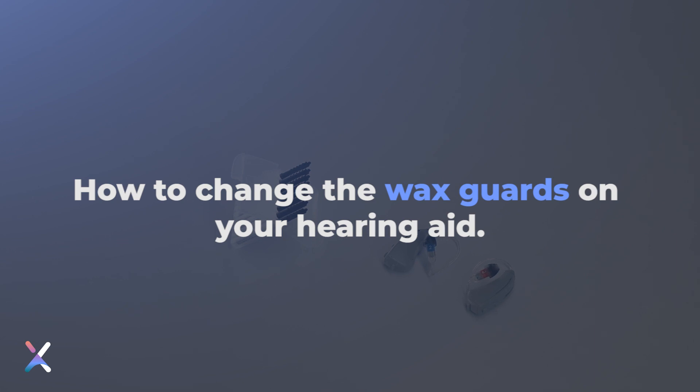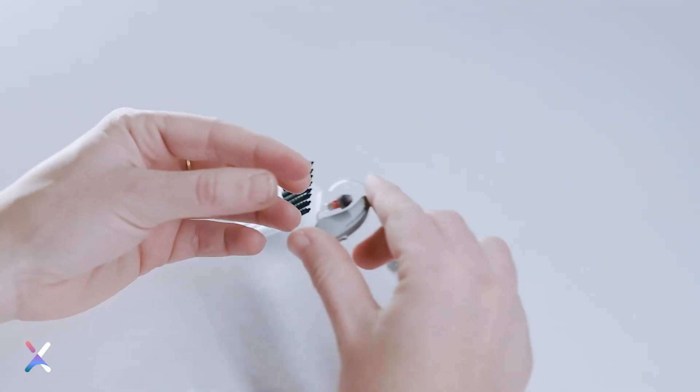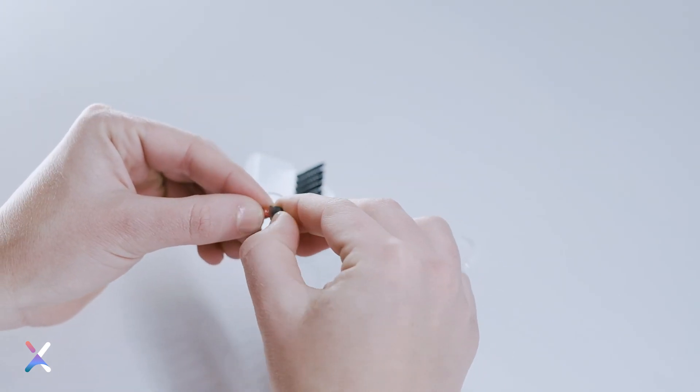How to change the wax guards on your hearing aids. A wax guard replacement tool is included with your new replacement wax guards. In order to replace your wax guard, begin by removing the dome from your hearing aid at the end of the receiver.